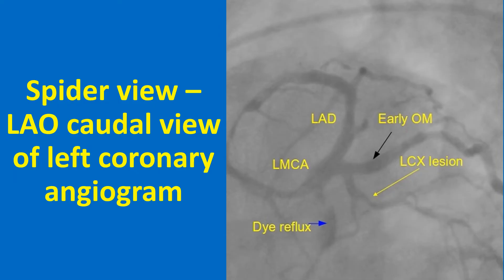In the spider view, LMCA is the left main coronary artery, LCX is the left circumflex coronary artery with a lesion marked by a yellow arrow, LAD is the left anterior descending coronary artery, and early OM is the early obtuse marginal branch of the LCX. From the LMCA bifurcation, the LAD is seen towards the catheter side and the LCX towards the opposite side. Dye or contrast reflux into the aorta from the LMCA is also seen.